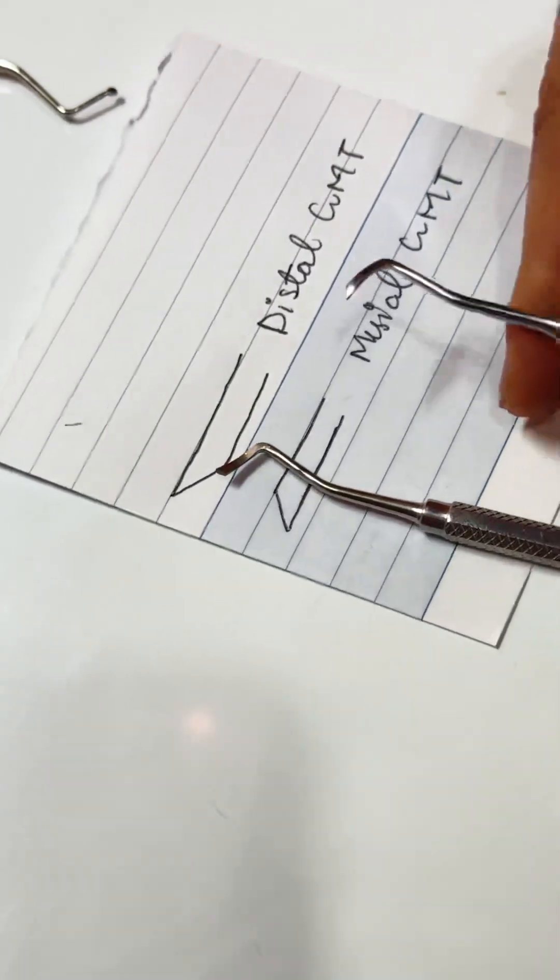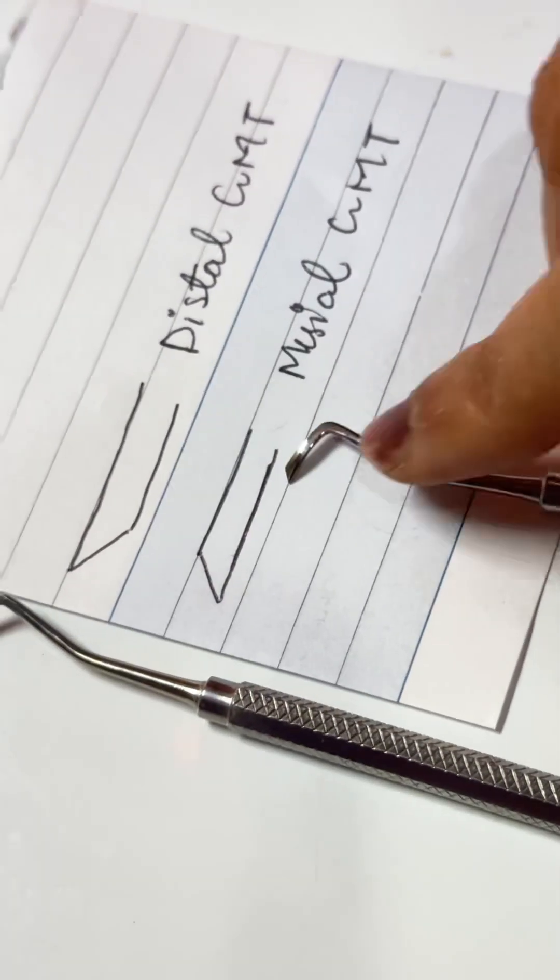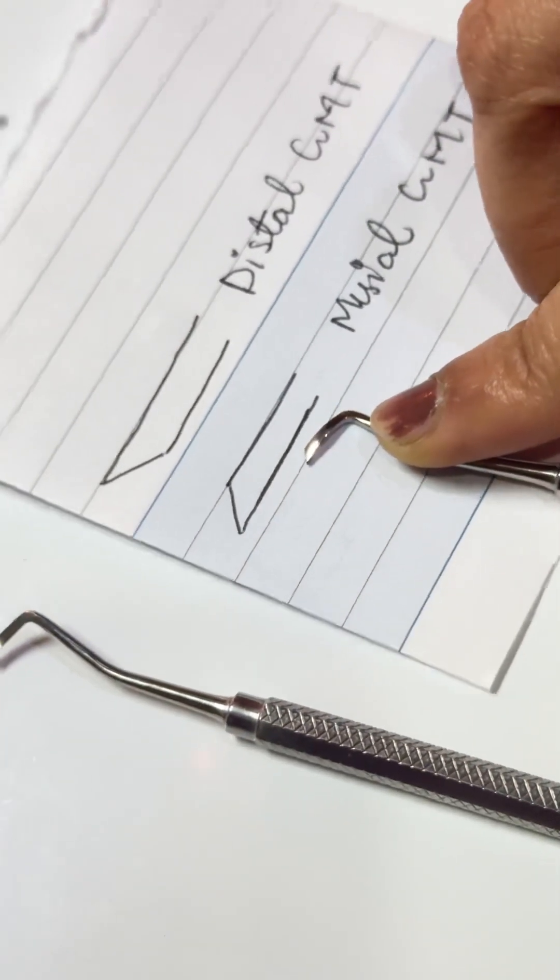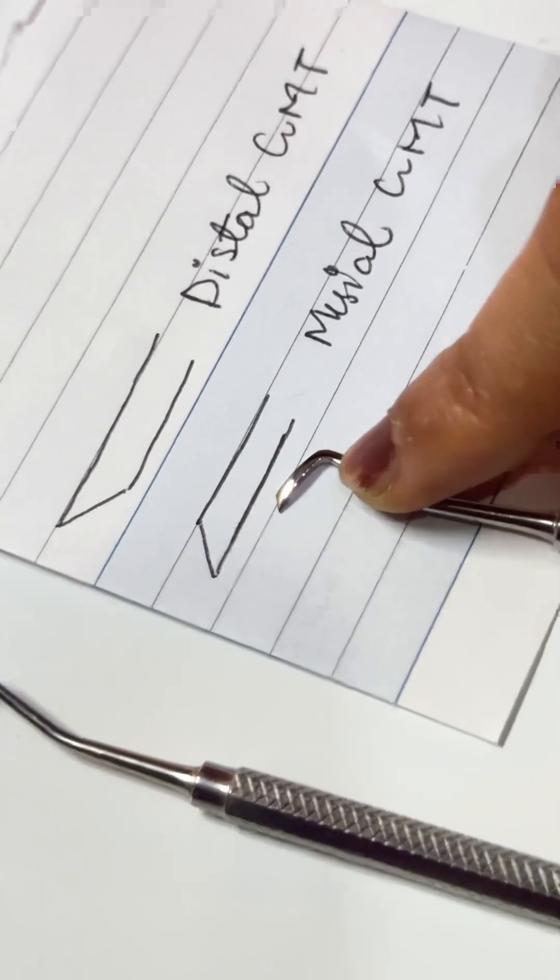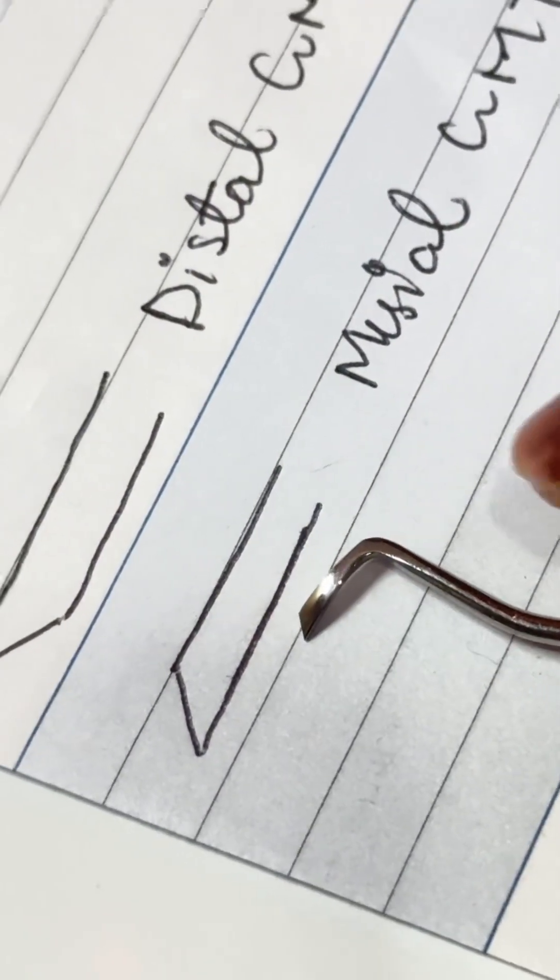And see this. Here the point is pointing downwards. As I have drawn, this is pointing downwards. So this is mesial GMT.